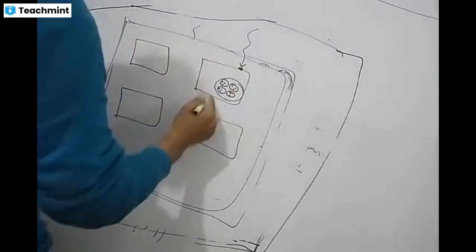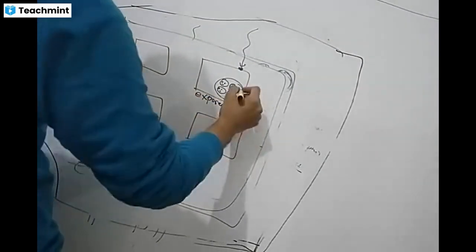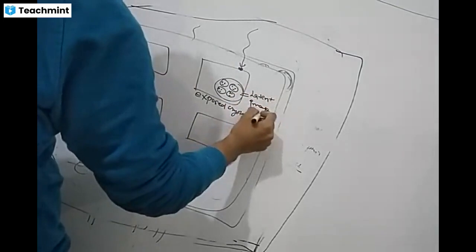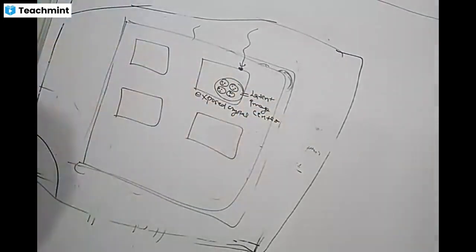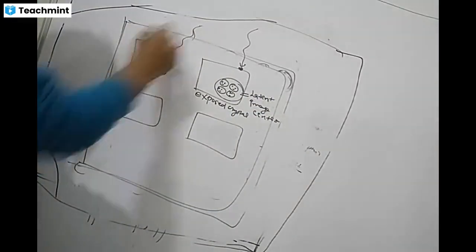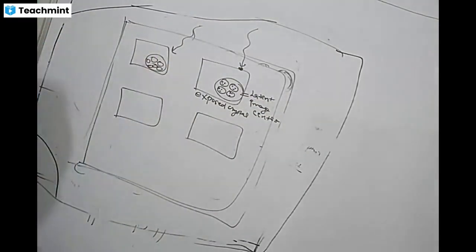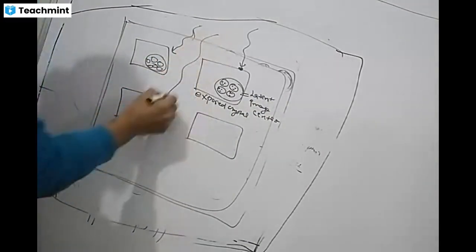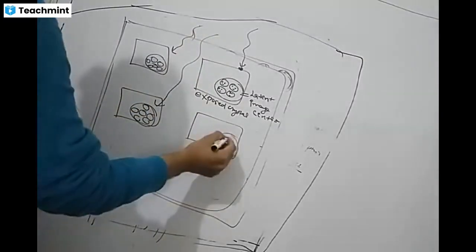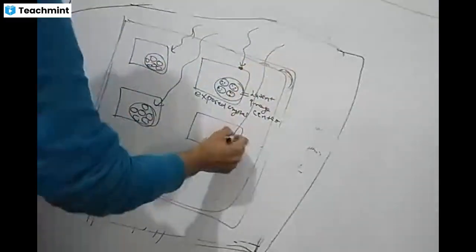So this crystal is called an exposed crystal, and this center is now called the latent image center. This is the terminology. Similarly, when one photon falls on this crystal, the same reactions happen, and here 5 silver atoms are reduced. In this one also some light photons fall, 1, 2, 3, 4, 5, 6, and here 4, 5, 6, 7, 8, 9, 10.